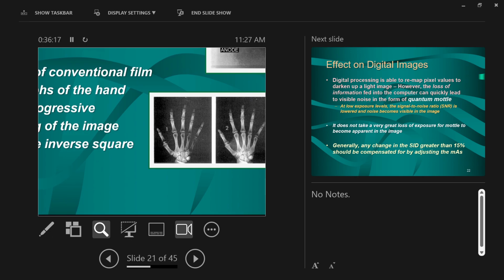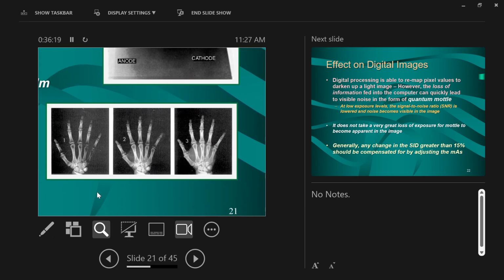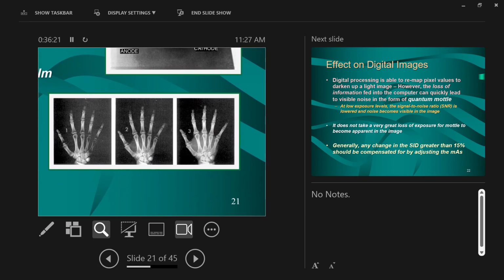These radiographs, at no specific distances, are showing you that if you look at image 1 through image 3, right? Image 1 was at one distance. It's sort of overly black, right? It doesn't show any soft tissue. You go to image 2, and without changing anything else, they just moved the X-ray tube further away, okay?